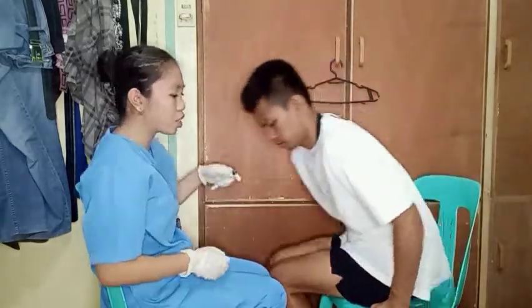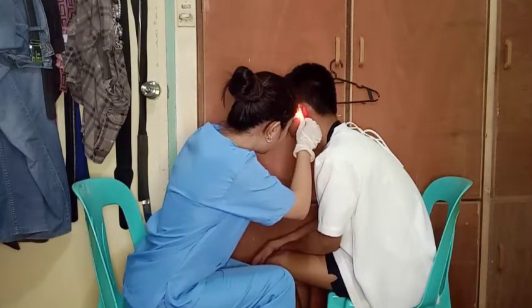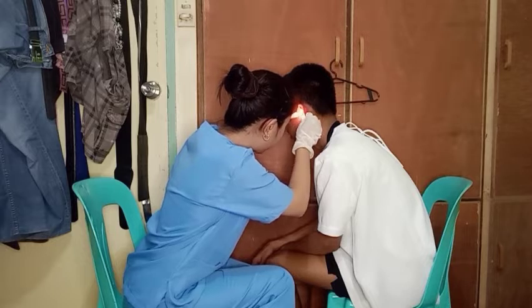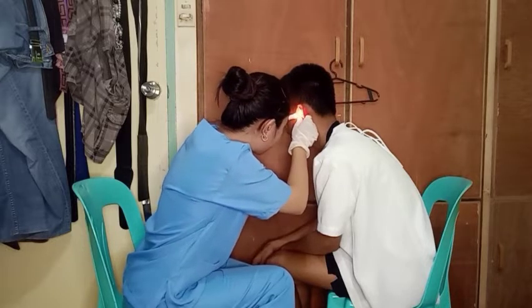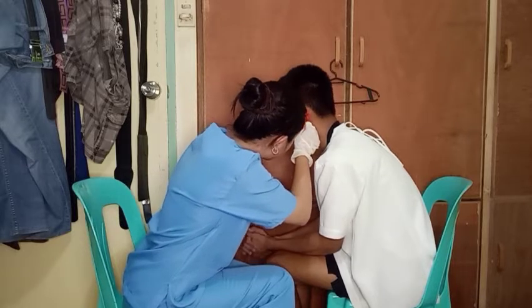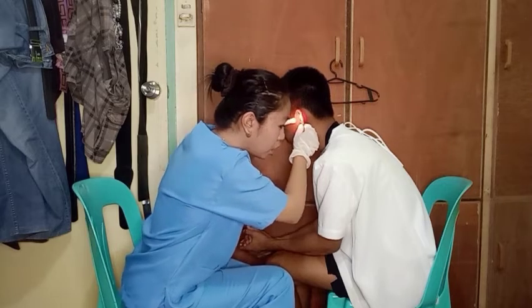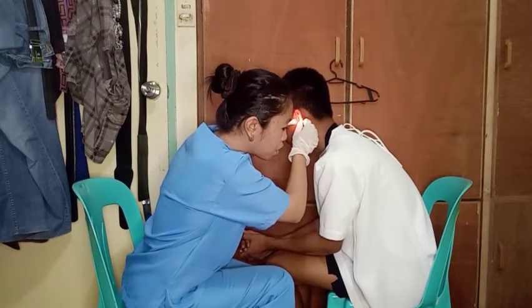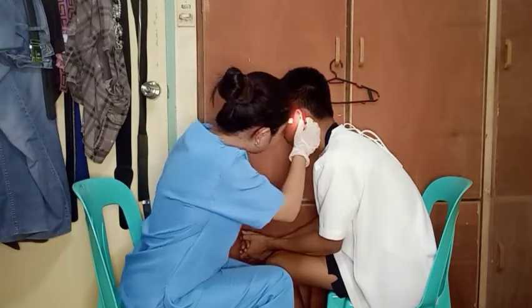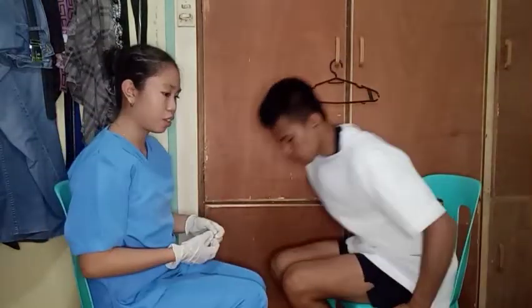Okay, to the other ear, sir. Okay, so I can see the color of the tympanic membrane is pinkish gray. There is also no laceration in the pars tensa and pars flaccida, which is a good sign. Also, the malleus and the short process are in oblique position, which means these are all good signs, sir.